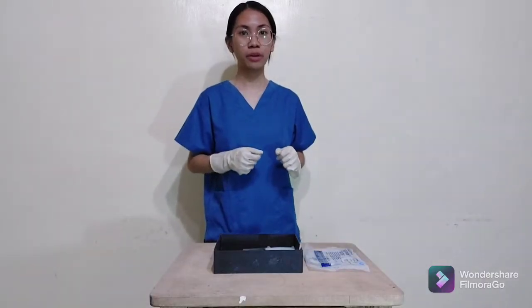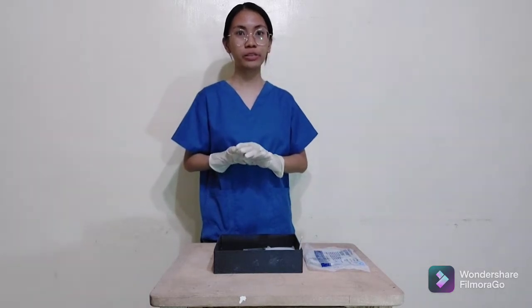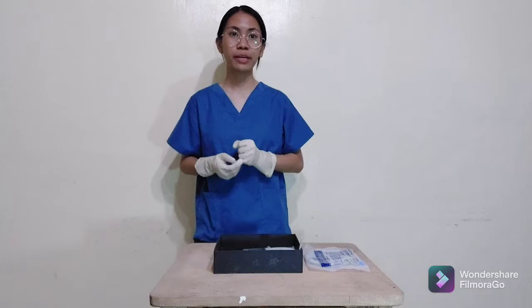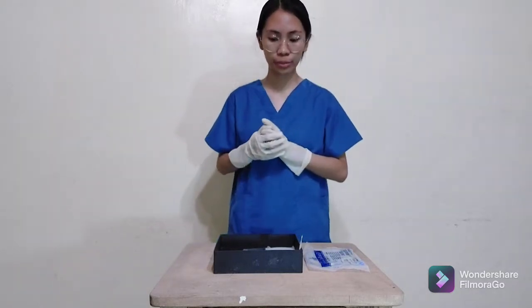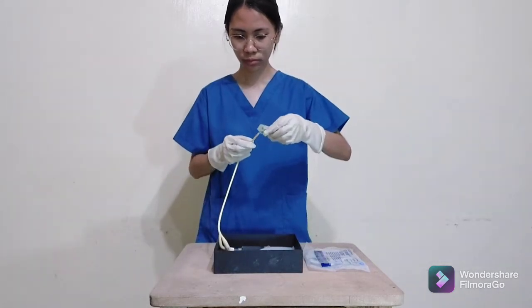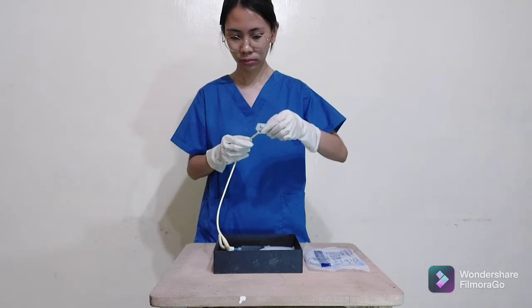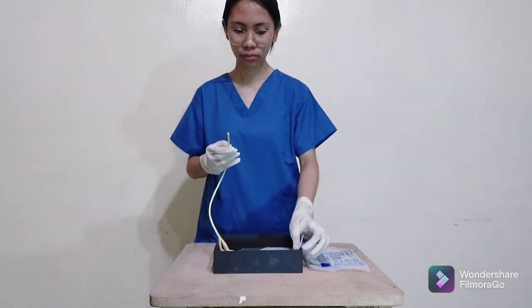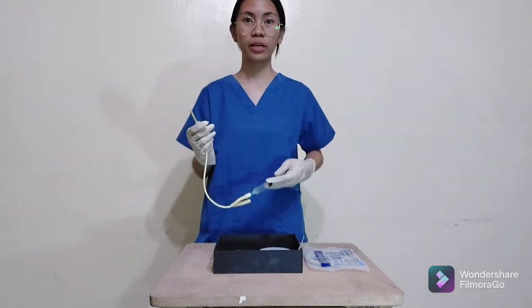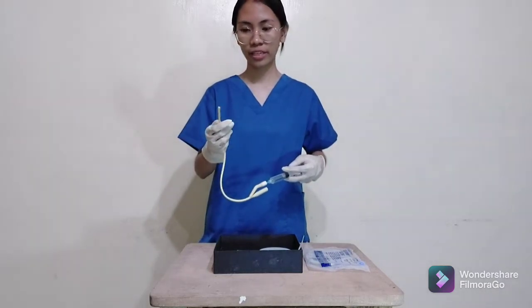Now lubricate the tip of the catheter using the sterile lubricant included in the tray, or add lubricant using sterile technique. Lubrication minimizes urethral trauma and discomfort during the procedure. And now let's check the balloon inflation using a sterile syringe. This maintains sterility of the catheter.